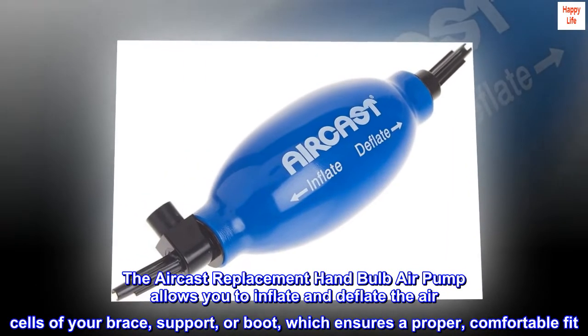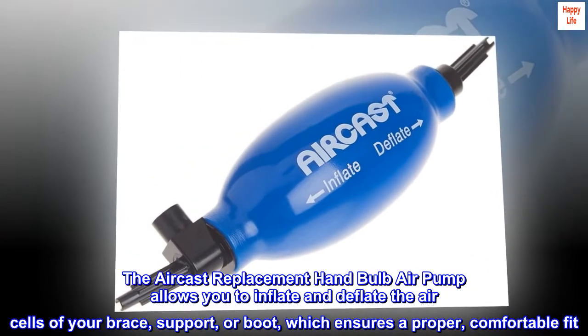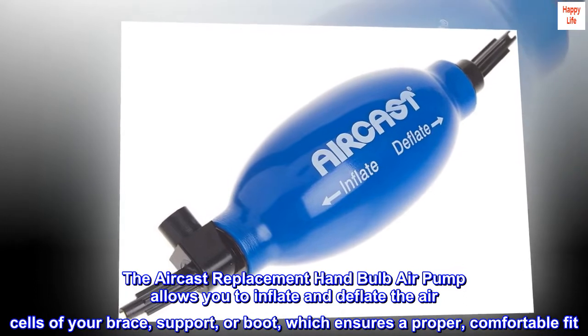The Aircast Replacement Hand Bulb Air Pump allows you to inflate and deflate the air cells of your brace, support, or boot, which ensures a proper, comfortable fit.